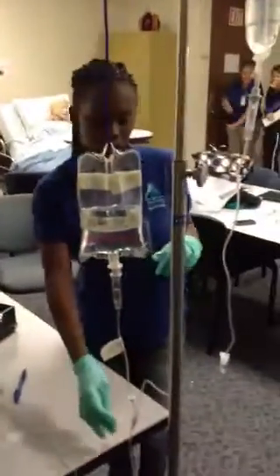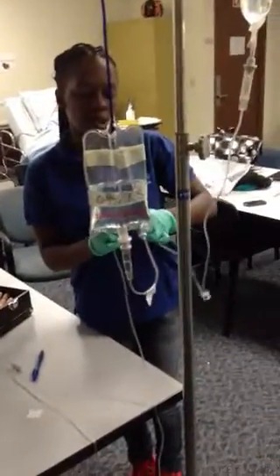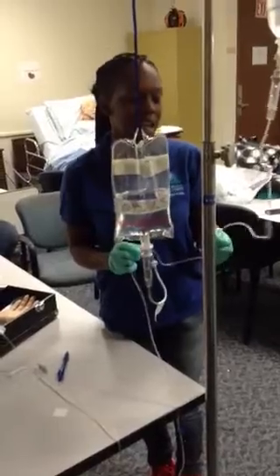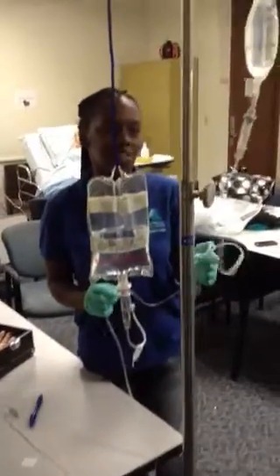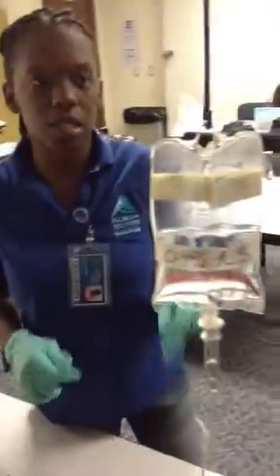I will disconnect my piggyback bag and put my alligator clamp on. Before I disconnect it, I would clamp it off. Then hang this up here, put my alligator clamp on the end, and hang it up here because it is done. This will still be going at its regular rate, so I can take this off, move this, and hang it back up here.